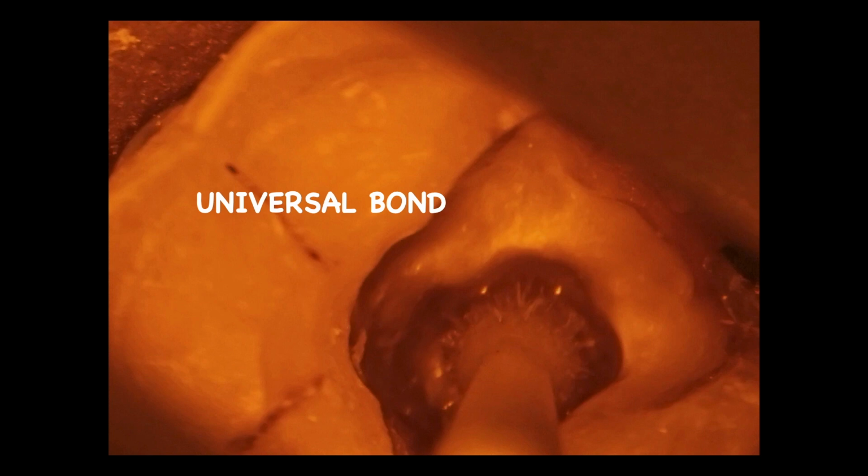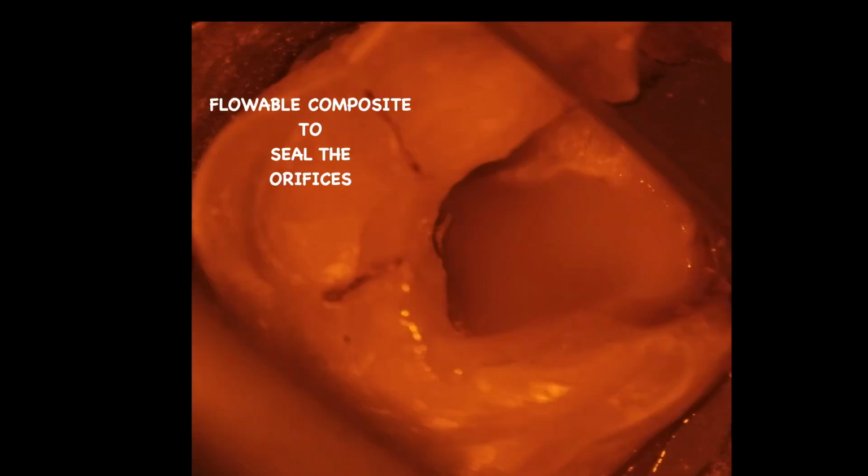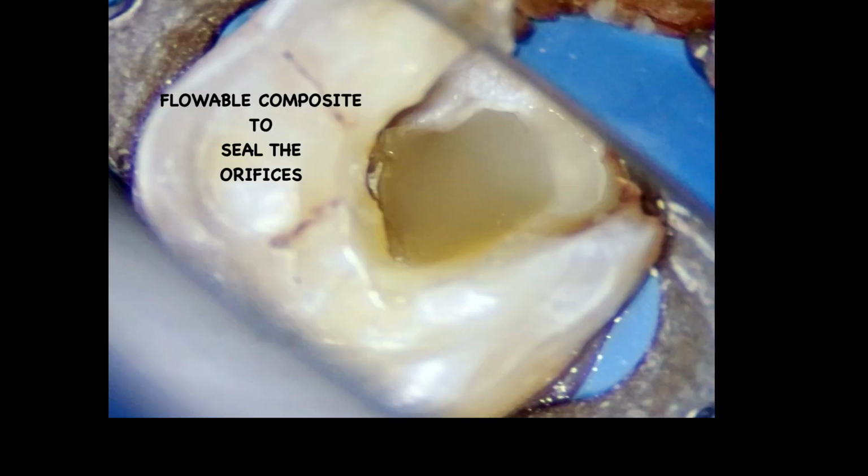So this we work with the microscope. We have the orange filters on. I apply the universal bond. Since it's only bonding to dentin, I don't have to etch. So I apply the universal bond over the floor of the pulp chamber that has been cleaned well, and light cure it. Followed by that, we inject some flowable composite onto the floor and cure this as well. So now I have a complete coronal seal.